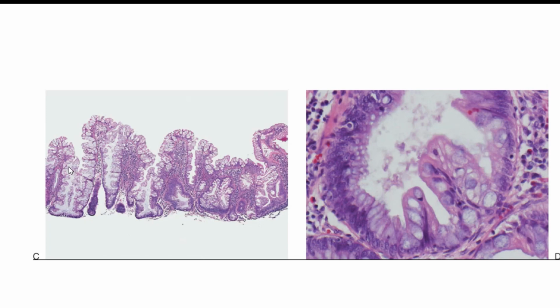In another picture, we can see this dilated crypt go all the way down. This is the high power to show this dilation.